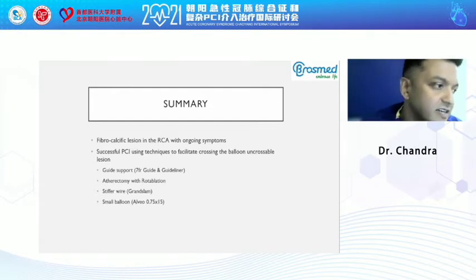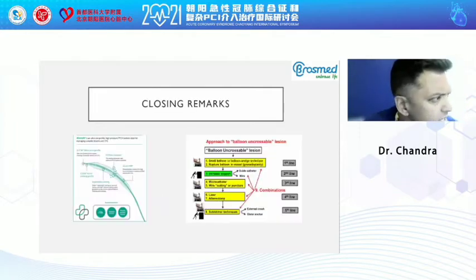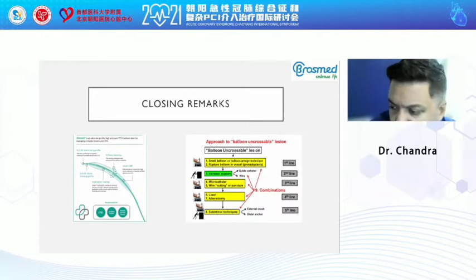So I guess in closing, I'll show that algorithm again. I think it's very important for all CTO operators, or people with an interest in developing in CTO, to have an awareness of these different techniques and be able to quite fluidly and rapidly combine a number of these steps simultaneously to achieve the best results where possible.